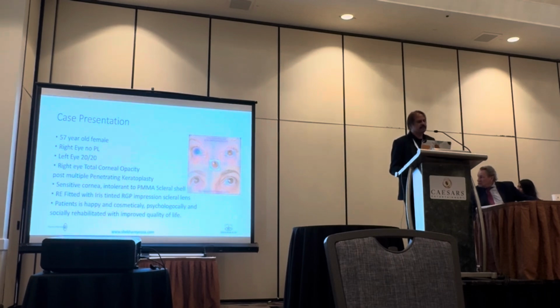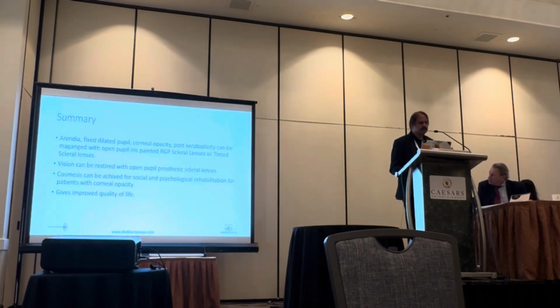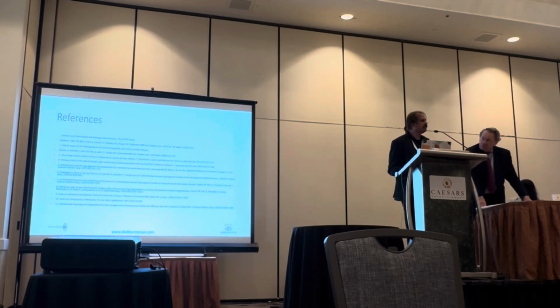This one particular patient I would like to talk about is in fact the mother of an ophthalmologist. She landed up with glaucoma, lost the cornea, multiple keratoplasties. Ultimately, we gave her the iris tinted scleral lens, and now she is absolutely normal, leading a good quality of life. So, using this technique can help some of your patients lead a normal life. These are my references. Thank you.